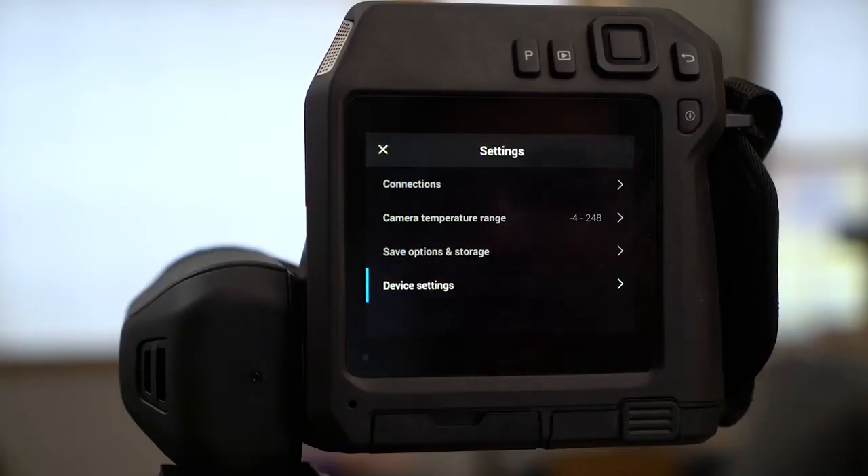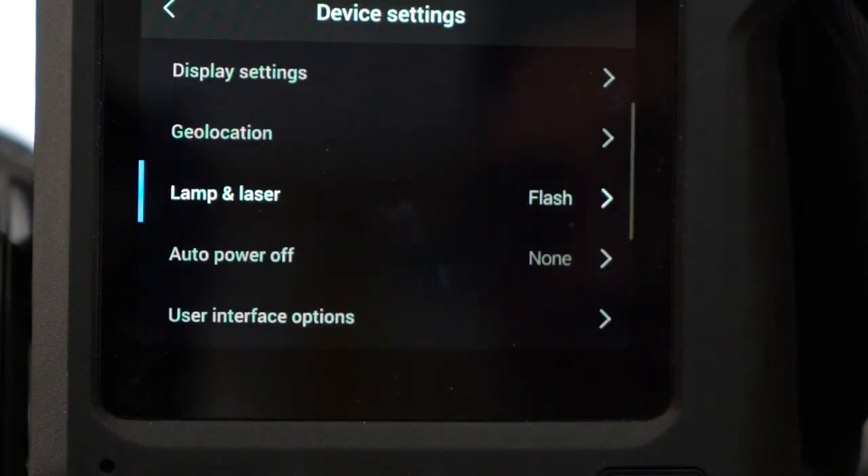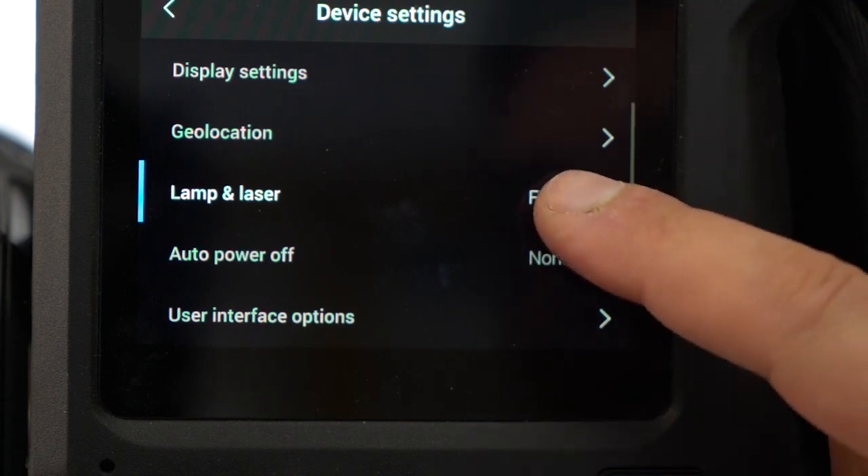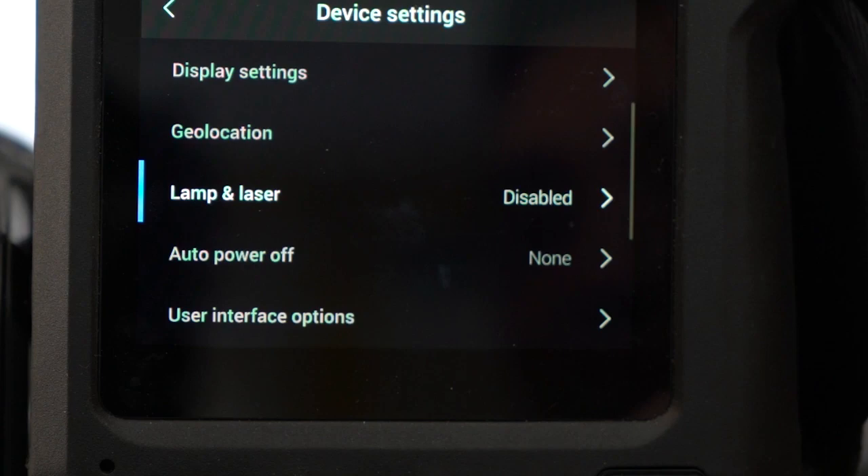Click the gear icon to take you to settings. Tap device settings. Then select lamp and laser. Select disable all to deactivate the lamp and laser.